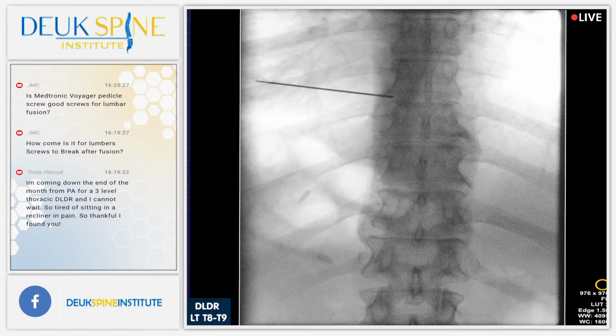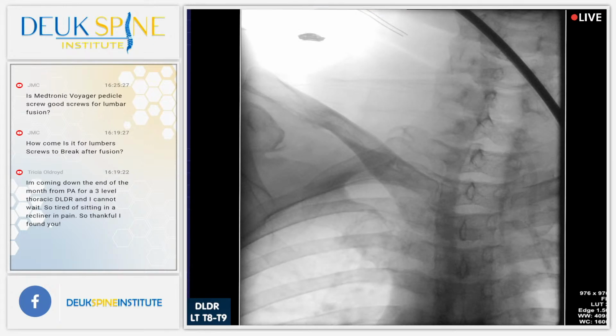Now let's go up to the cervical spine. Maybe a little less penetration. You're a little bit overexposed. Let's count down from the first rib if we can to verify from top to bottom, bottom to top. It's always good in the thoracic to verify top to bottom, bottom to top. All right, so there's the first cervical rib. Let's count.